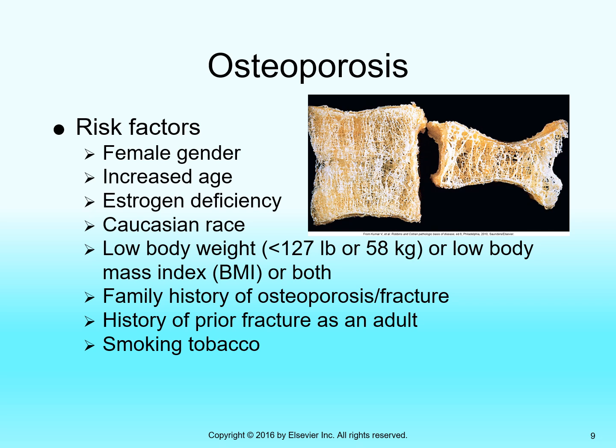The one that's been collapsed, the spongy bone looks thinner, with a lot more open spaces and a lot less of those cobweb-looking, angled web, the trabeculae. So there are not as many trabeculae on the compressed vertebrae, and it's called a compression fracture, versus the normal vertebrae, which has more bony trabeculae.